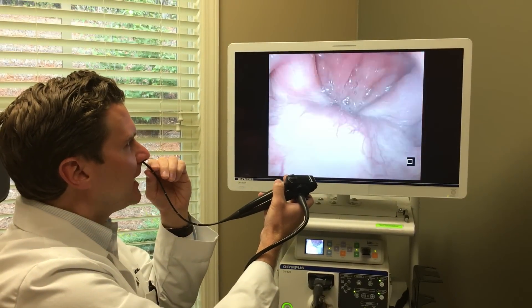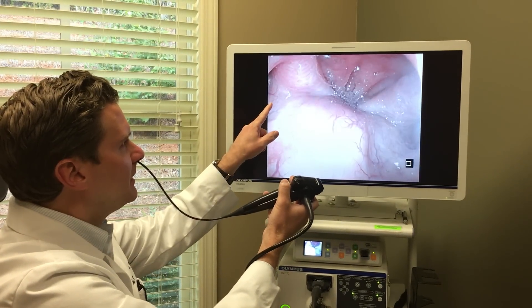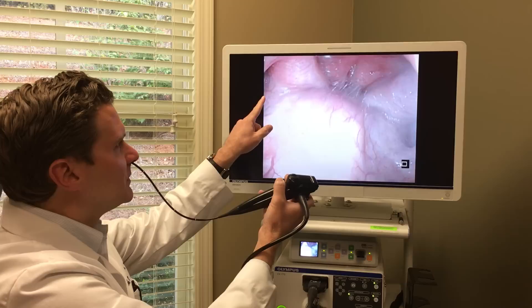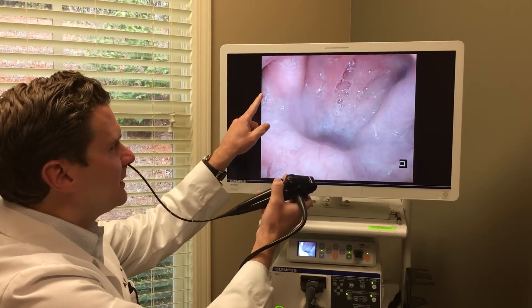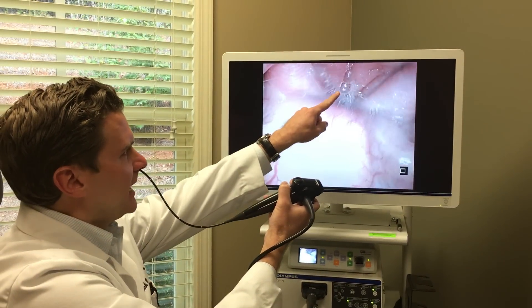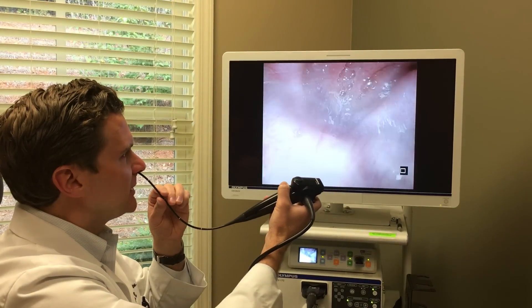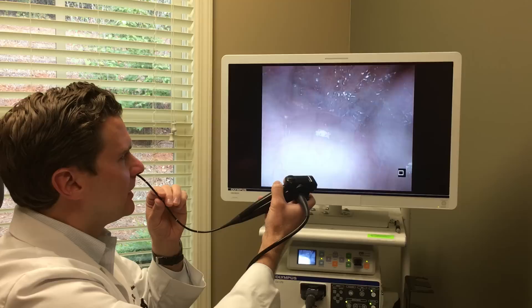So now we're in the back of my nose. This little area here, that's the eustachian tube opening — that goes to the ear. This is where the adenoids would be. I don't have much adenoid tissue.